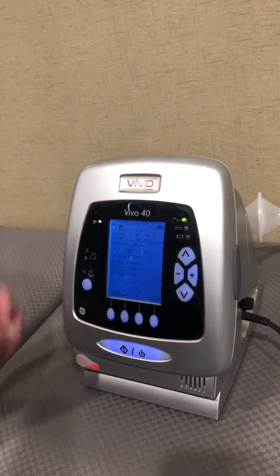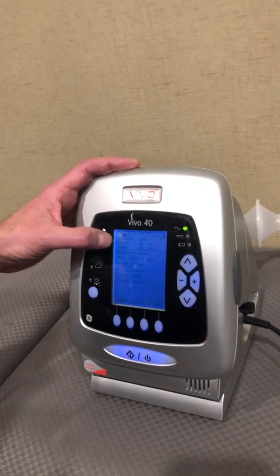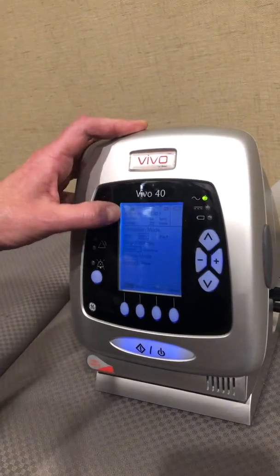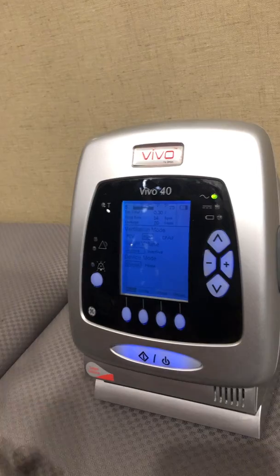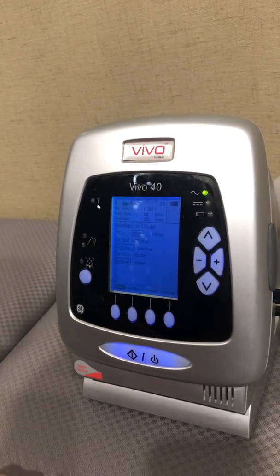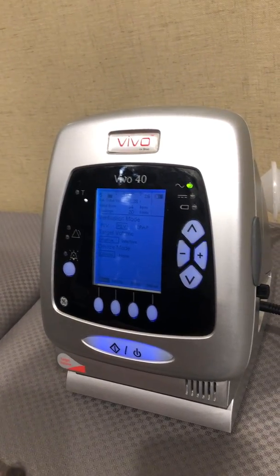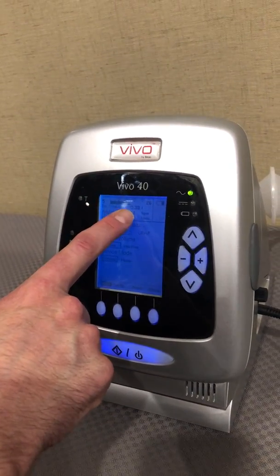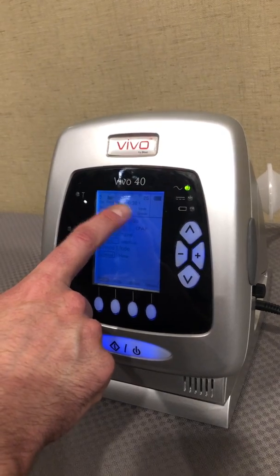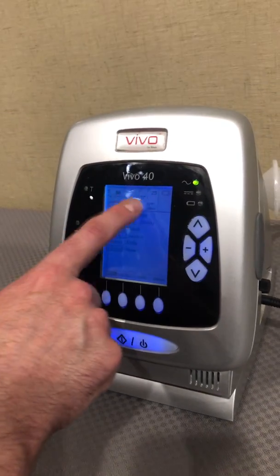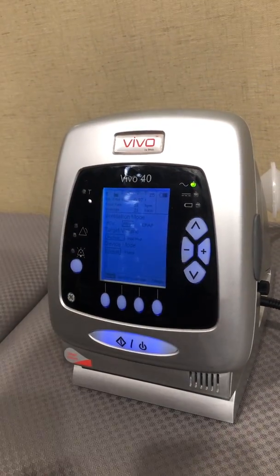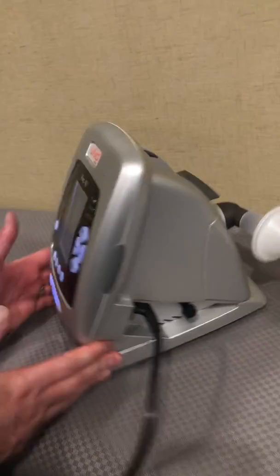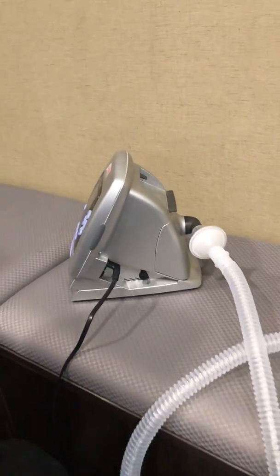Up at the top we have our patient values. That tidal volume, as you can see, is slowly climbing and should eventually get to 500.